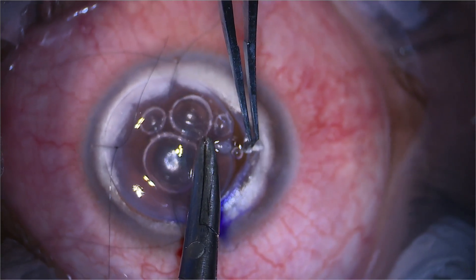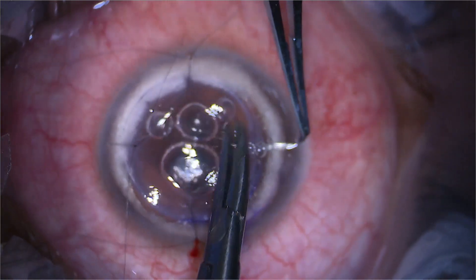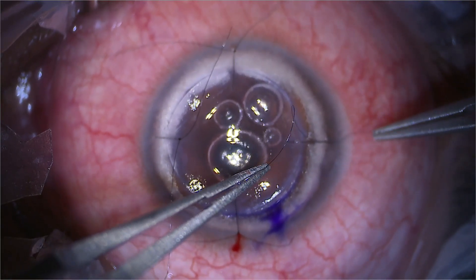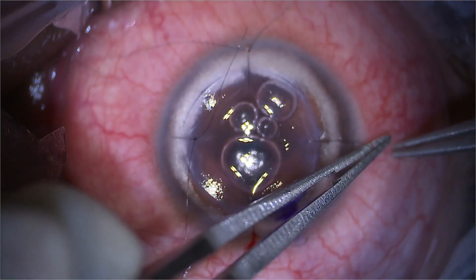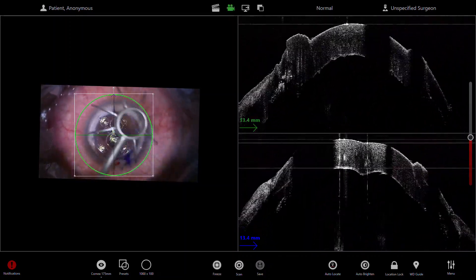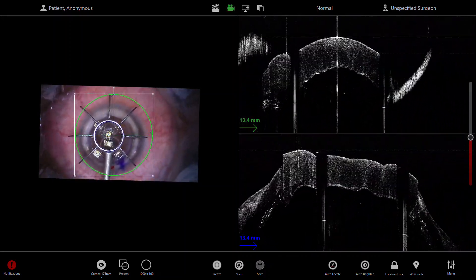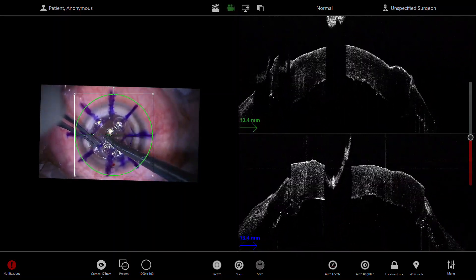With a DALK, keep the edge of the needle facing horizontal rather than facing downwards, and use the flat part of the needle to just push down the Descemet's membrane while going across. The OCT is quite useful to look at the graft and look at the Descemet's membrane and make sure there's no double AC. Here I'm doing the star marking just to act as a guide.